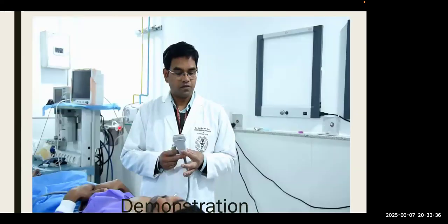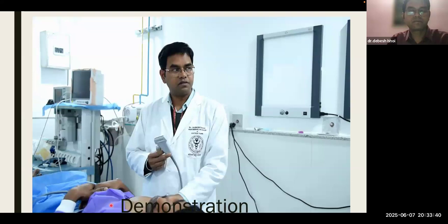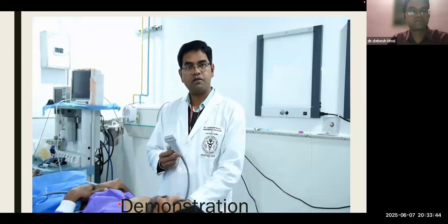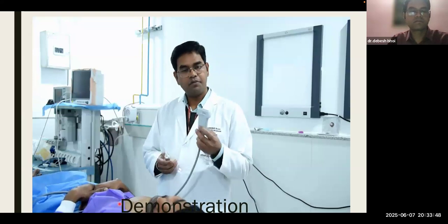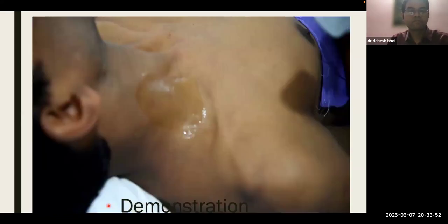Yes, sir, audible. In this case, we are going to demonstrate the brachial plexus, and the most common blocks are the interscalene, supraclavicular, or axillary block. For this you need a high frequency linear probe, and the patient is positioned supine with just a little bit of head up.